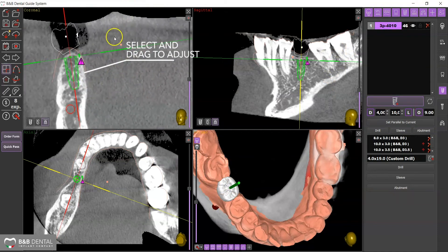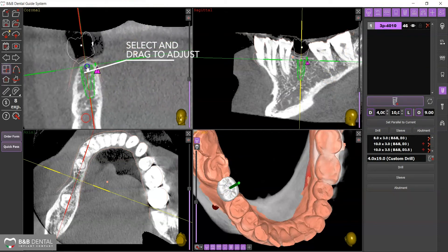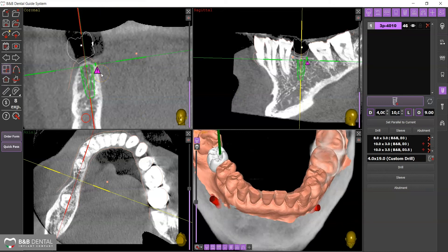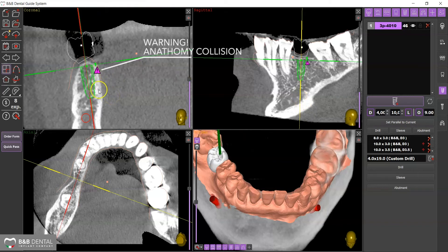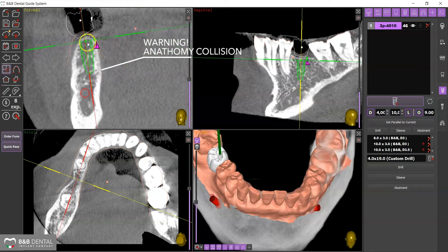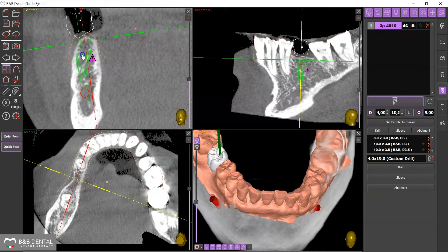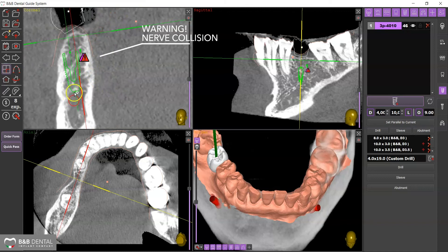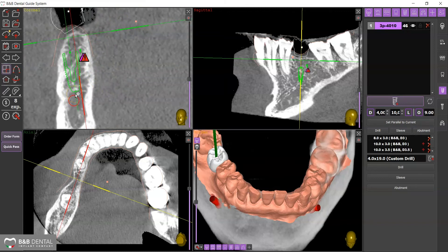Select the implant from either display and move it to adjust its position. The appearance of a magenta warning triangle indicates a collision between the sleeve corresponding to that implant and an anatomical element provided by the profile of the STL file. A red triangle instead indicates proximity to the nerve.